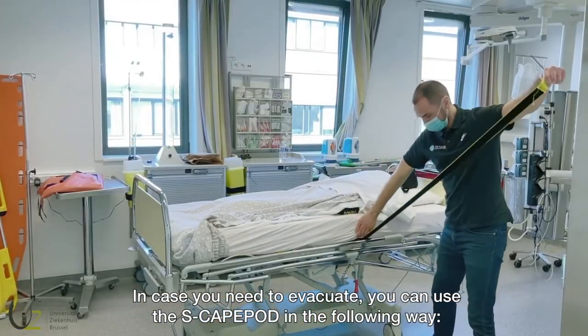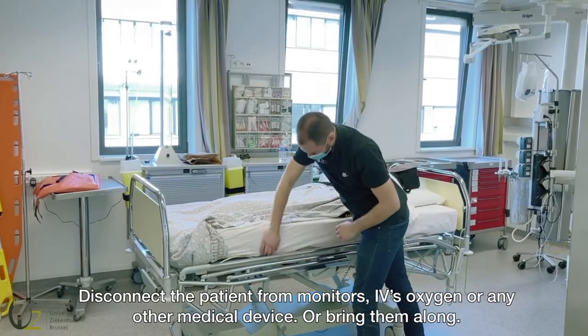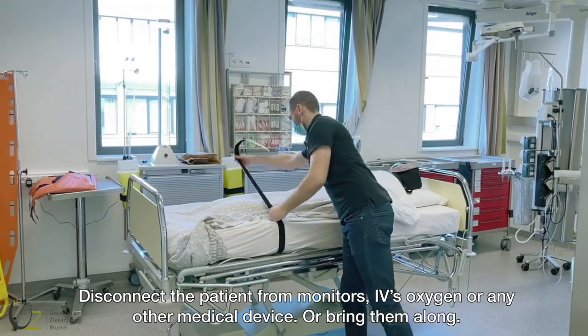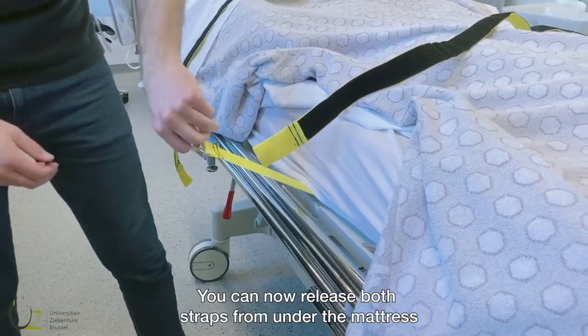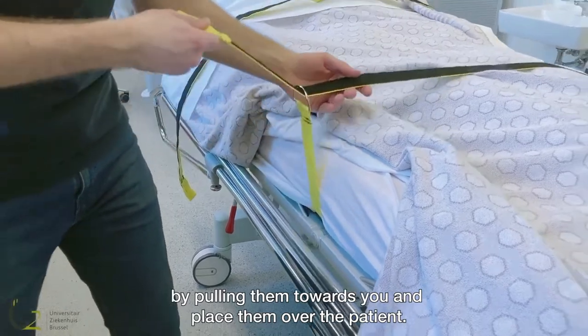In case you need to evacuate, you can use the ESCAPE pod in the following way. Disconnect the patient from monitors, IVs, oxygen or any other medical device, or bring them along. You can now release both straps from under the mattress by pulling them towards you and place them over the patient.